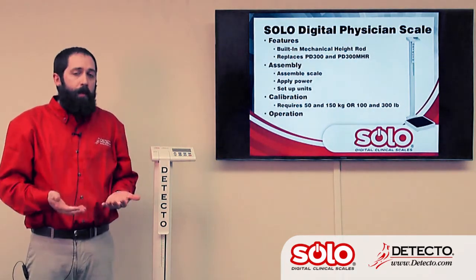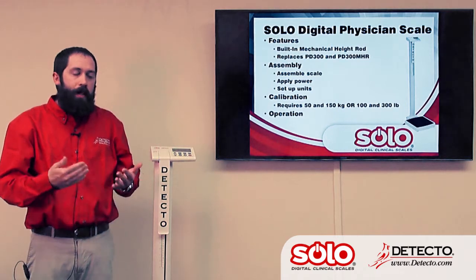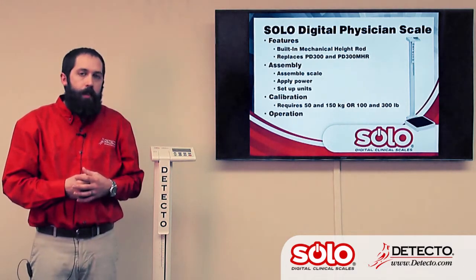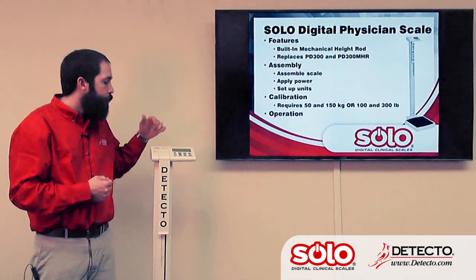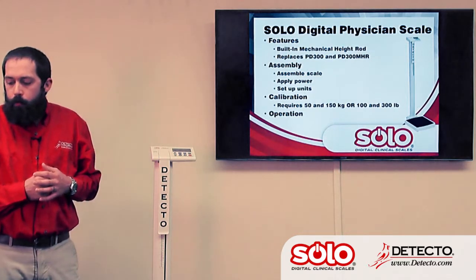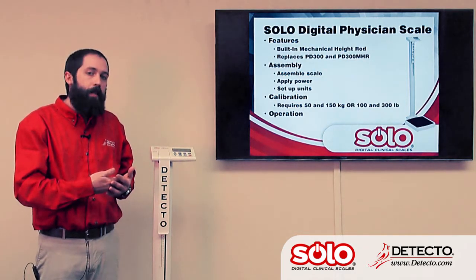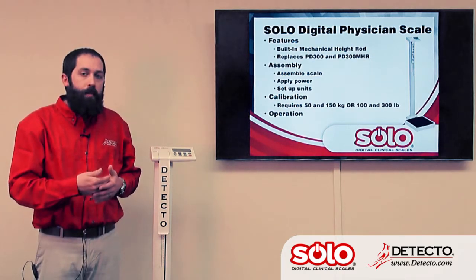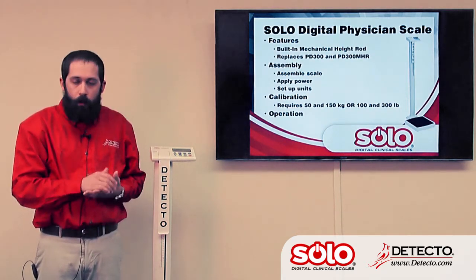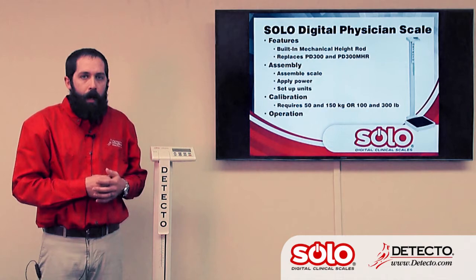To use the scale and simply weigh on it, it's a matter of stepping on the scale and it will automatically lock on the patient's weight. Whenever the patient steps off, the weight automatically unlocks and returns to zero. If it's desired to hold that weight longer, we have a lock/unlock key that will hold the weight until that button is pressed again. To use the BMI feature, it's the same procedure except when the weight is locked, you press the BMI key and it allows you to enter the patient's height using the up and down arrow keys. Once the height is entered, press the enter button and it will display the BMI for that patient.